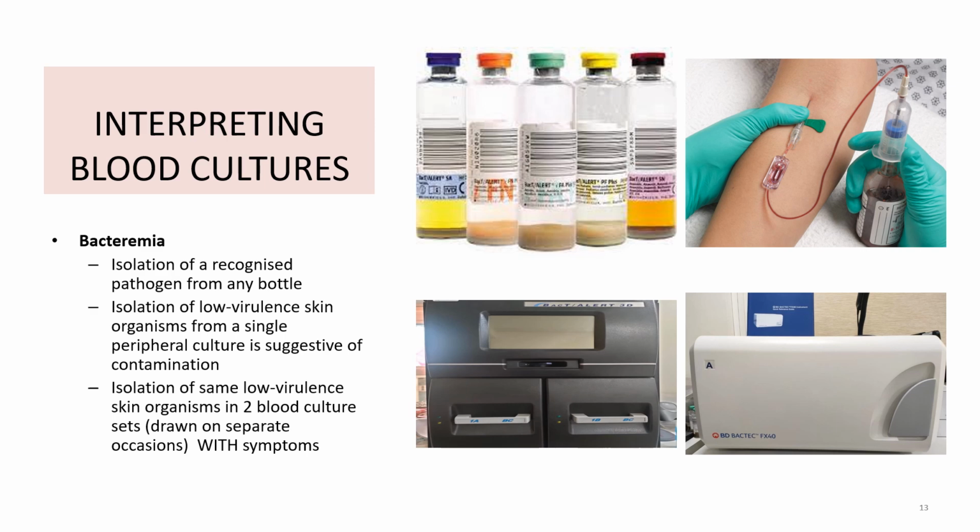When interpreting blood cultures, it is necessary to collect paired blood cultures from symptomatic patients. The paired blood cultures should include at least one aerobic and one anaerobic bottle, and from both arms. It increases the yield of the organism from patients suspected of infections.